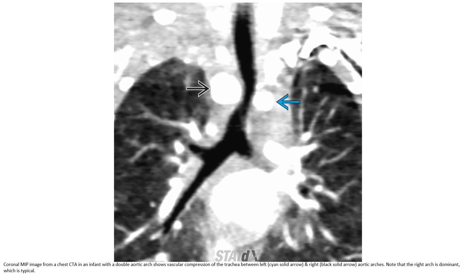Coronal MIP imaging from a chest CTA demonstrates a double aortic arch showing cross-sectional compression of the trachea between the left and right aortic arches. Note that the right arch is dominant with its typical appearance.